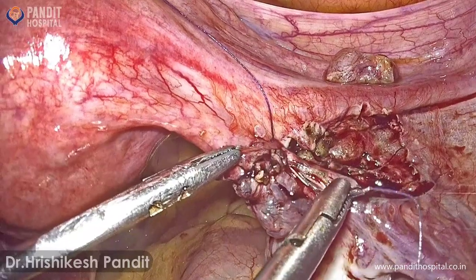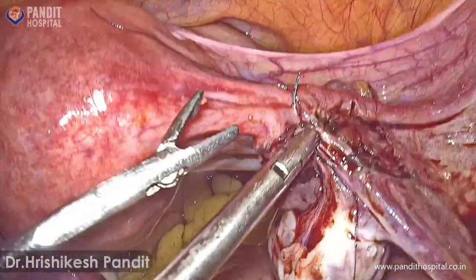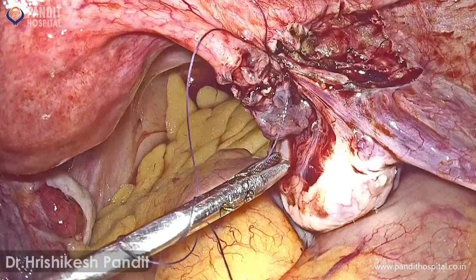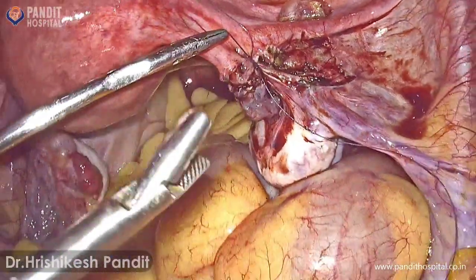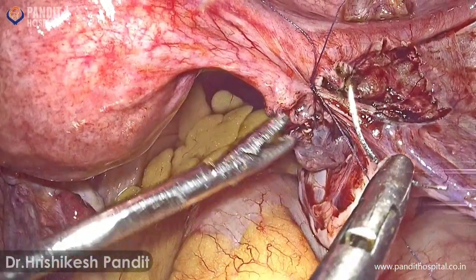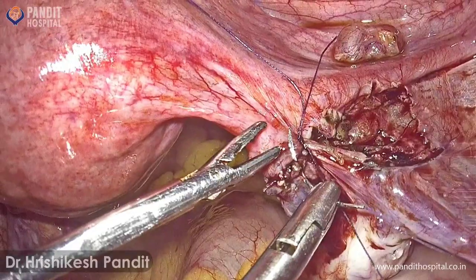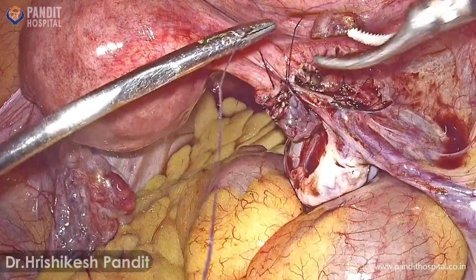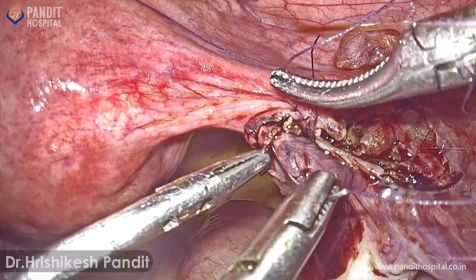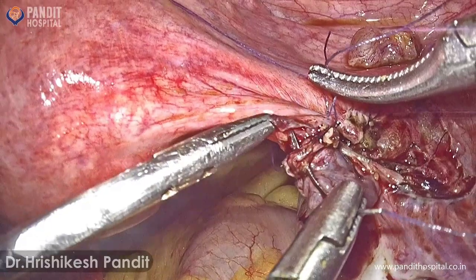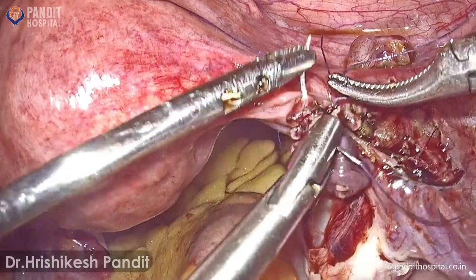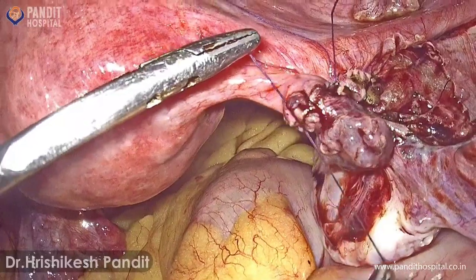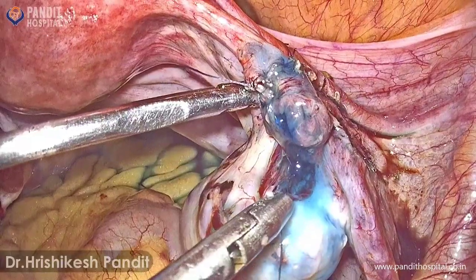There are two schools of thought about suture material and suturing technique. Some prefer monofilament sutures so that tissue reaction is minimized. We are using Vicryl here because it is easier for tying the knot. Another point is that some people prefer interrupted closure of the serosa; we prefer continuous suturing of the serosal layer.